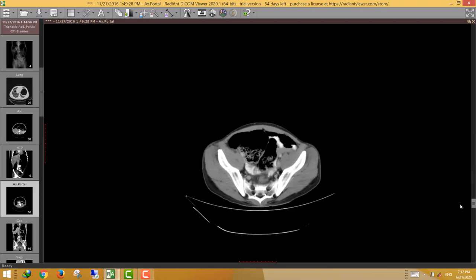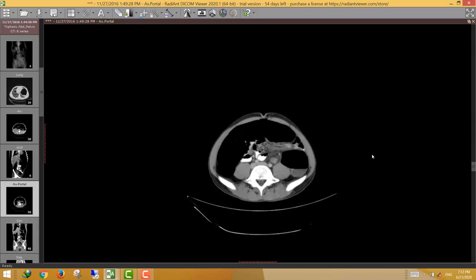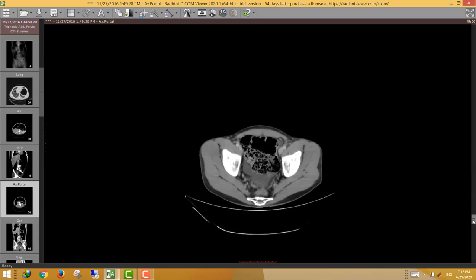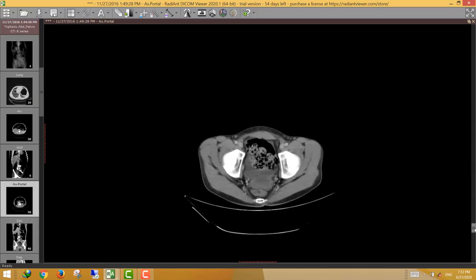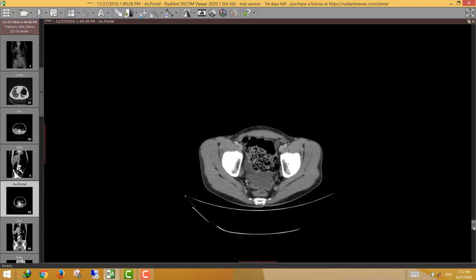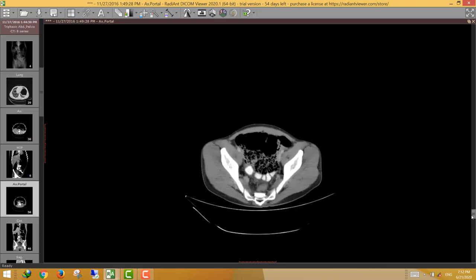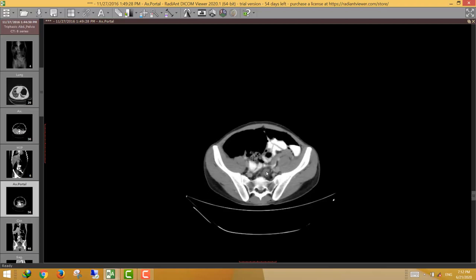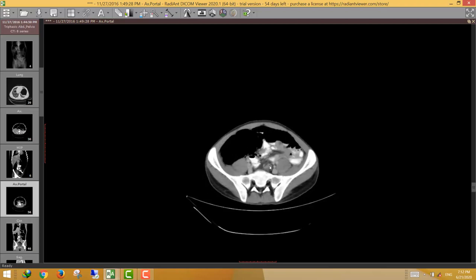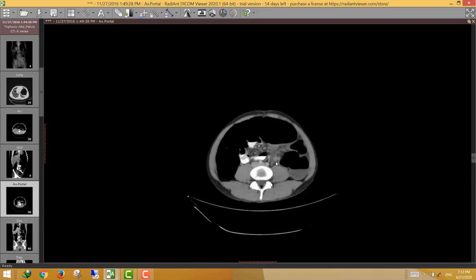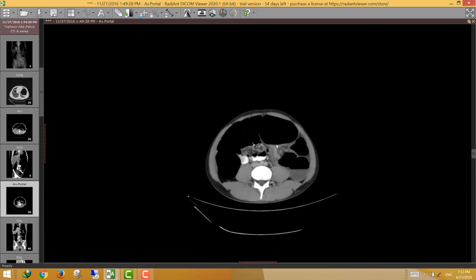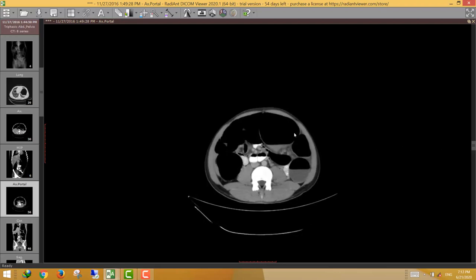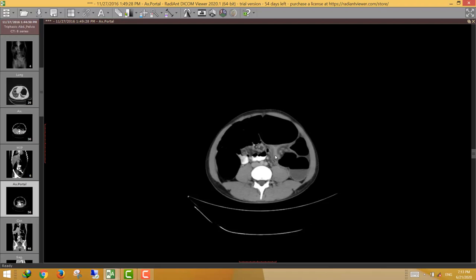As a rule, to localize the transitional zone, start from the rectum and extend proximally. The rectum is seen here, extending proximally to the sigmoid. Here is the start of the marked dilatation — the transitional zone.